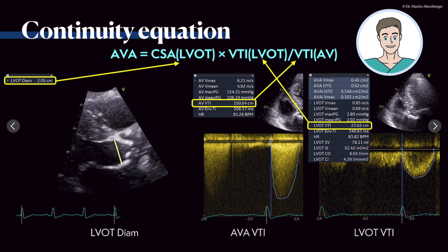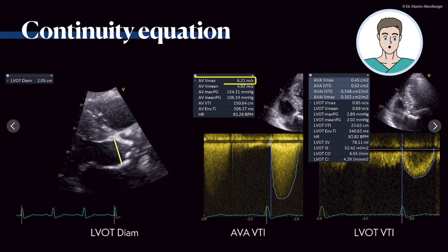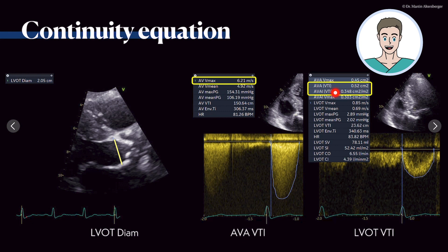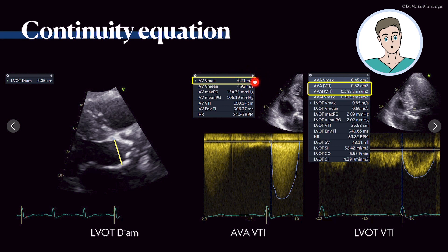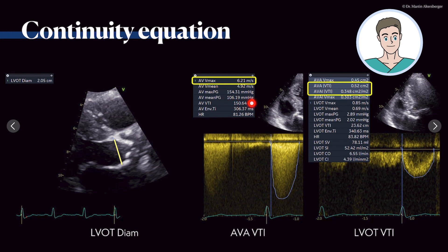When you calculate that, you can see this is truly a severe aortic stenosis: the aortic valve area is 0.52 square centimeters — a very, very small area for blood flow. This is truly severe, even critical aortic stenosis. Indexed, it is approximately 0.35 square centimeters per square meter body surface area. The maximum velocity is above 6 meters per second — 6.21 meters per second. The mean pressure gradient is an enormous 106 millimeters of mercury, compared to the severe threshold of 40 millimeters of mercury.